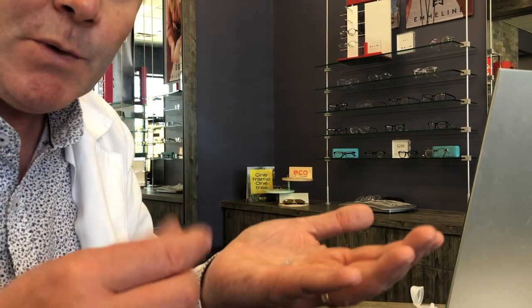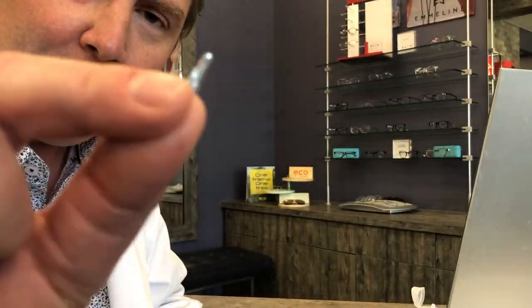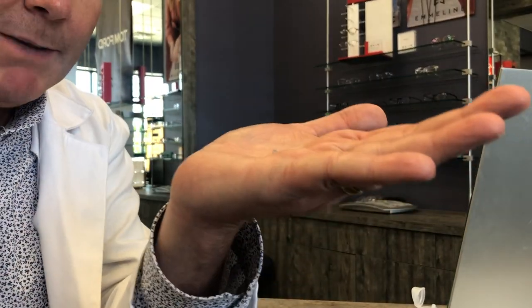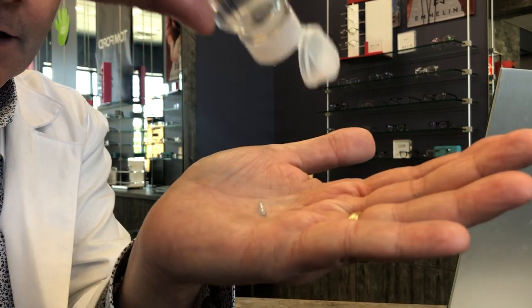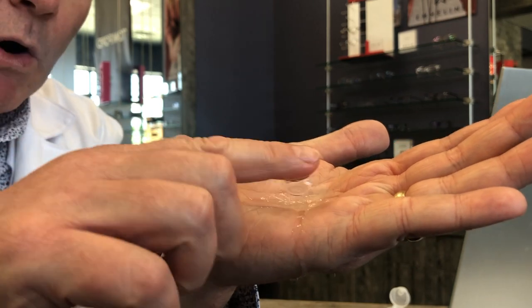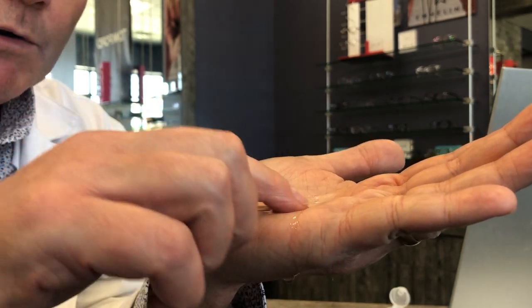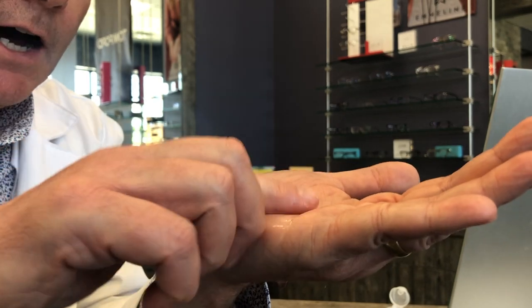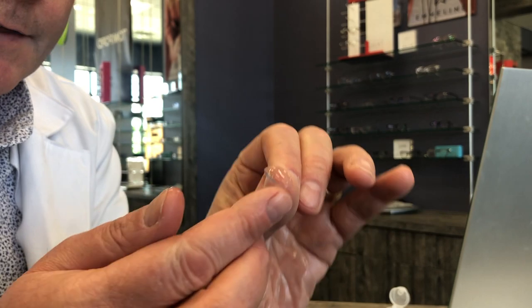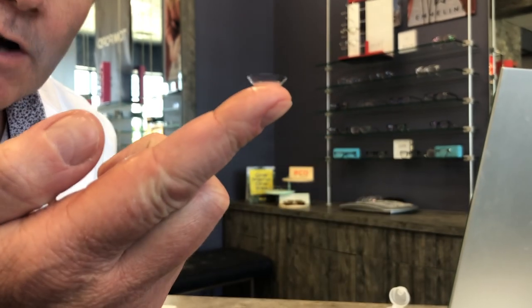Sometimes after working with a contact lens for a while it kind of rolls up or sticks together. To get the lens apart, don't go in and peel it — you're likely going to tear it. Instead, place the lens in the palm of your hand, take a little bit of contact lens solution, put that on the lens, and roll it in the solution. That's going to unfold it and then you can place the contact lens on your eye.